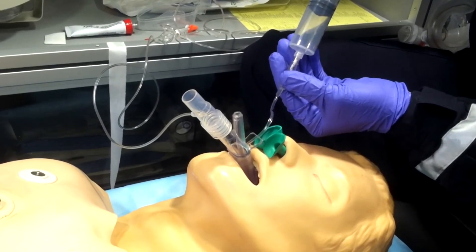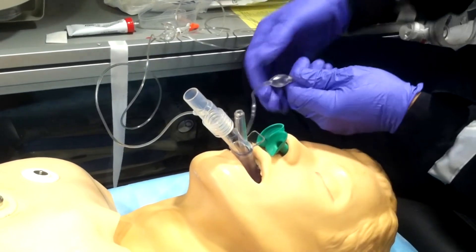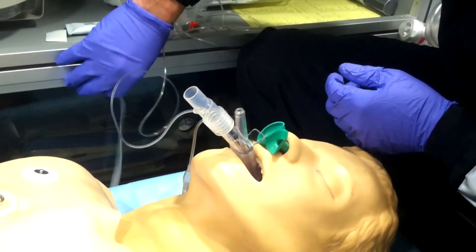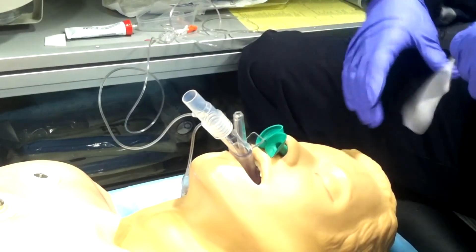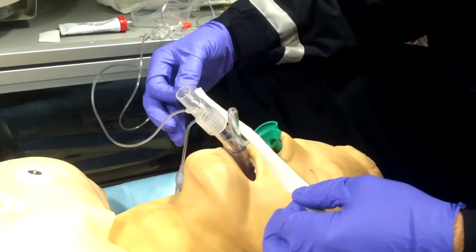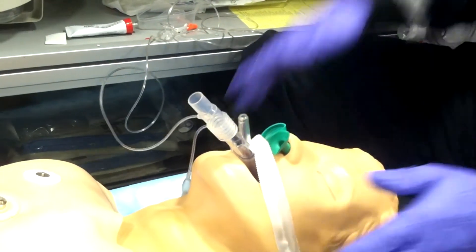Then you're going to inflate the cuff. Watch the way my partner inflates — it's more of a feel than anything. I don't want you inflating to max pressures and causing structural damage. You want to feel for it: there should be a little bit of play between your two fingers and the bulb itself.